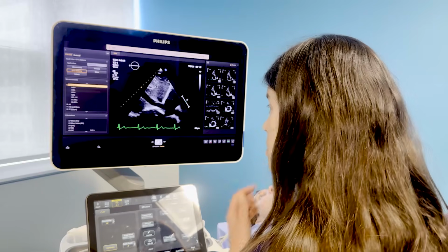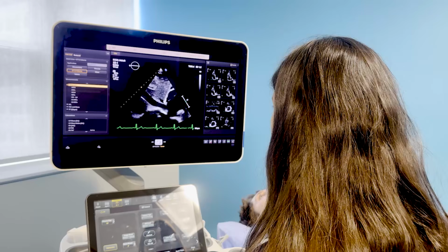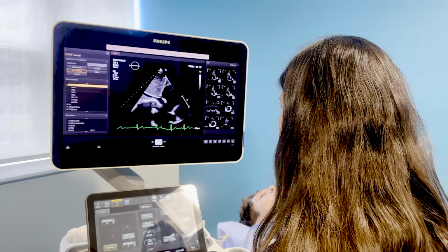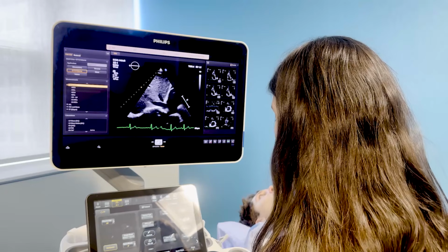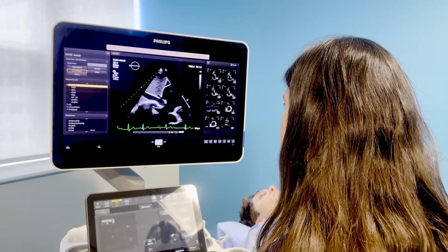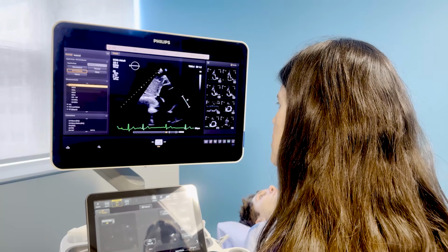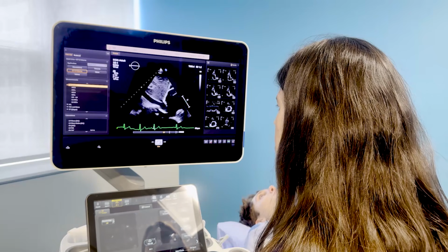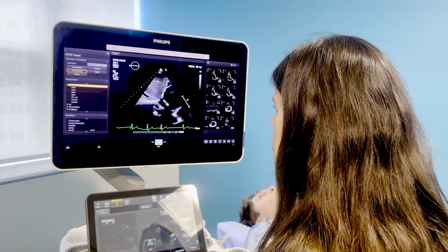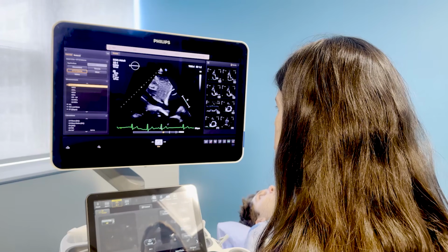Then we're also wanting to make sure that the IVC is collapsing well. And you just take a big sniff through your nose for me, Mateo. Good. And breathe normally. And you can appreciate that collapsed really well. And how much collapse are you looking for? You're looking for more than 50% collapse. His IVC was not dilated, and it collapses greater than 50% fully, so we give him a right atrial pressure of 3.